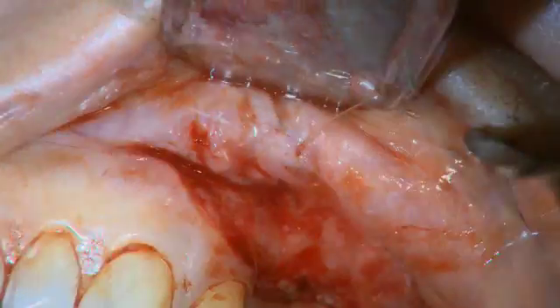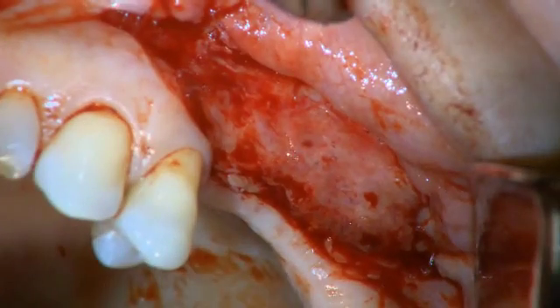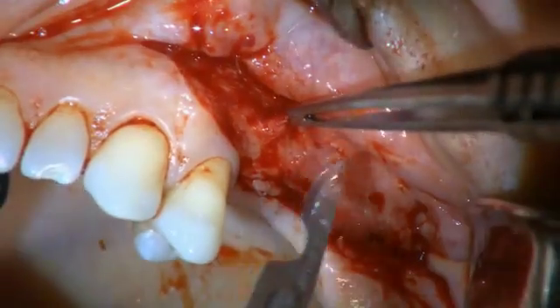Here we utilize T-mattress sutures to hold the tissue in its new position, revealing the periosteal bed. Then any extra mobile mucosal fibers are removed.